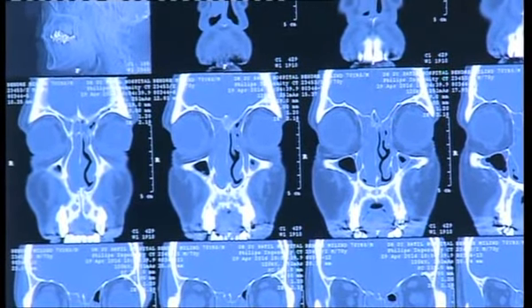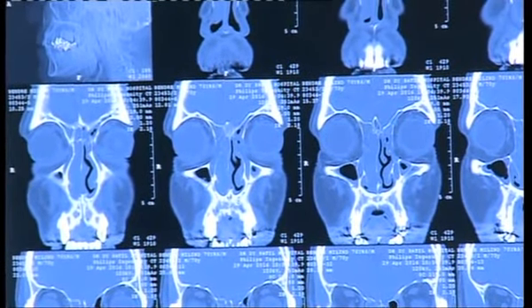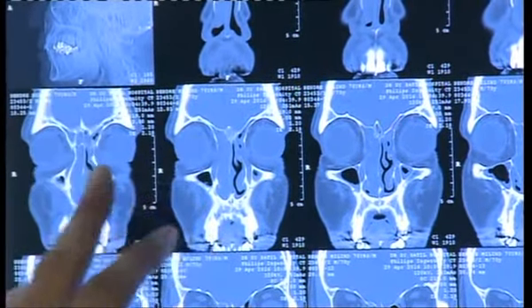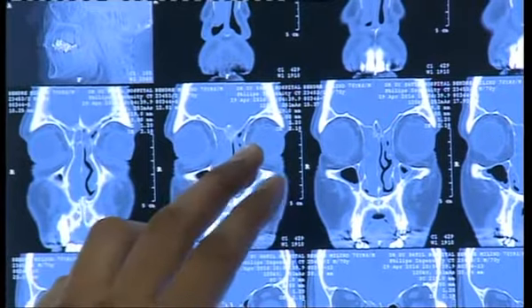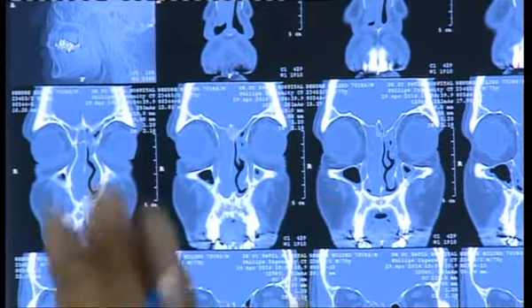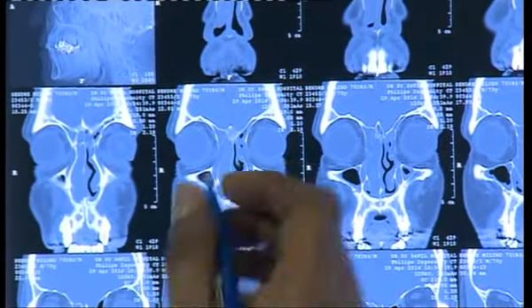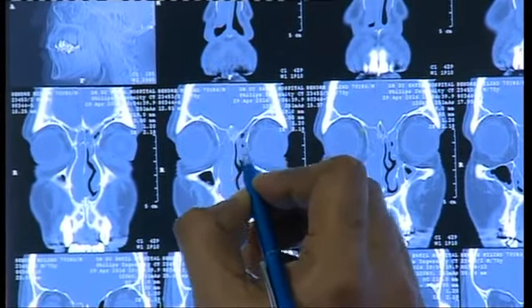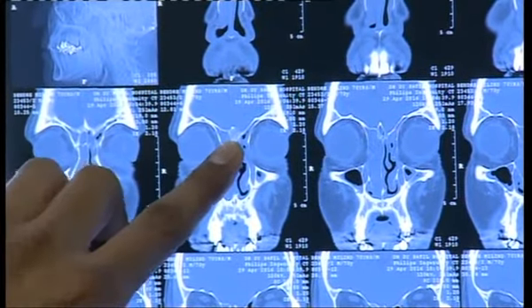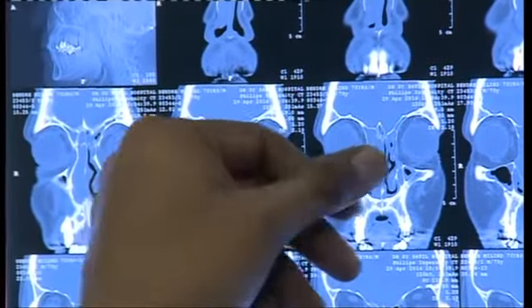See, what is agger nasi, like you mentioned, that is pneumatization of the lacrimal bone. The ethmoidal cells pneumatize the lacrimal bone, and in relation to the nasolacrimal system, the first cell appearing in this region is the anterior-most cell. If I put in an endoscope, you'll see above the axilla, even anterior to the axilla, is the prominence of these agger nasi cells. And here I can appreciate some pneumatization. This looks like a cell, and this is most likely the agger nasi cell in this region. These are the most anterior cells on CT scan when you come from anterior to posterior.